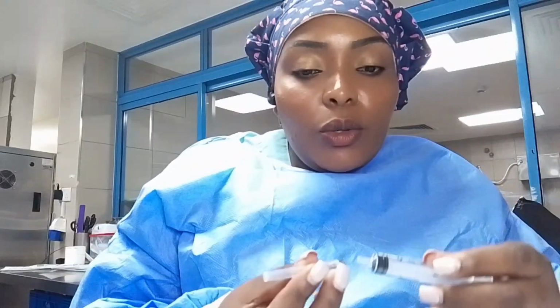You have to arrange the kit in a sequence according to how you will require the items. First things first, you will need this one.